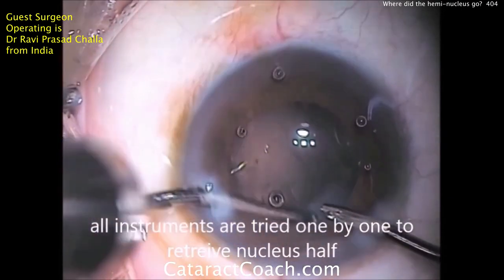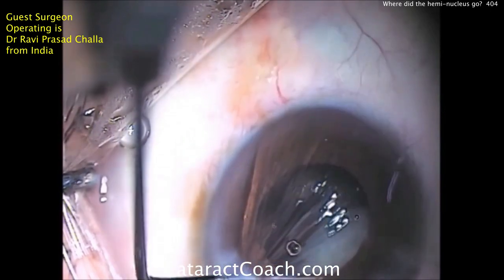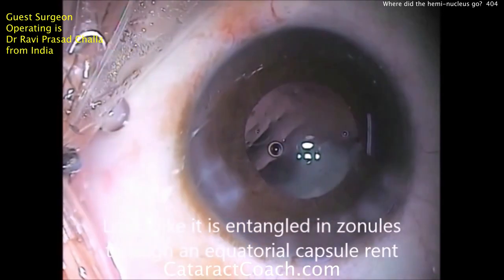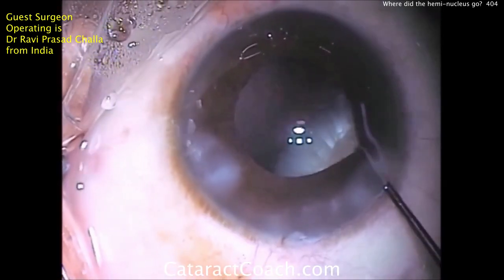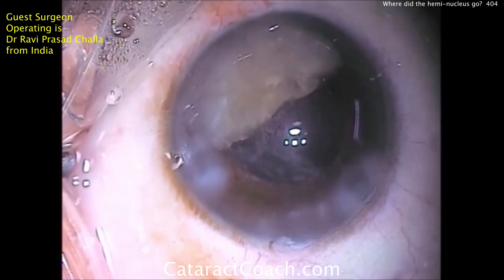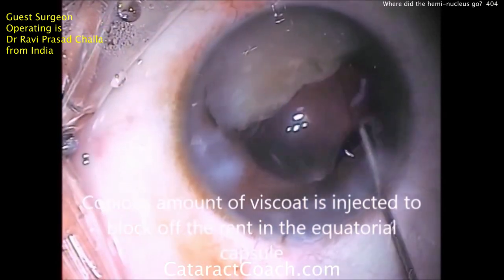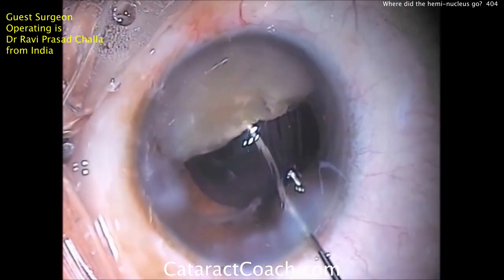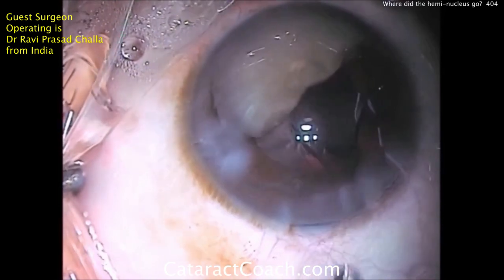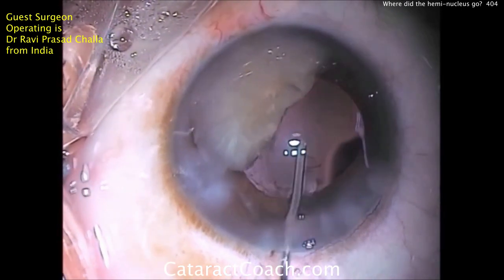Dr. Challa is going to take his time here and do a beautiful technique. It's still stuck — there's the heminucleus, you can see it. Now, we don't advocate fishing in the vitreous cavity as that's going to cause issues, but here he's doing it in a very safe manner and the piece is not in the vitreous cavity — it's through that defect, but not floating in mid-vitreous. He successfully brought the second heminucleus up, added more viscoelastic to create a barrier and keep that second heminucleus up. He's also very smartly using that nasal angle — keeping that piece pushed against the nasal angle is very good because that prevents it from slipping through the pupil.